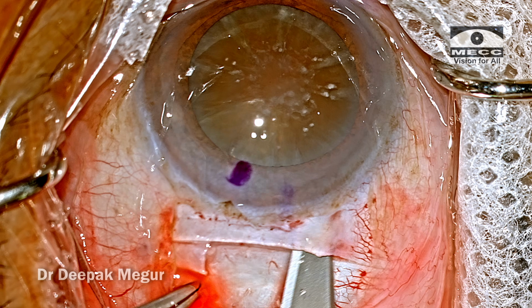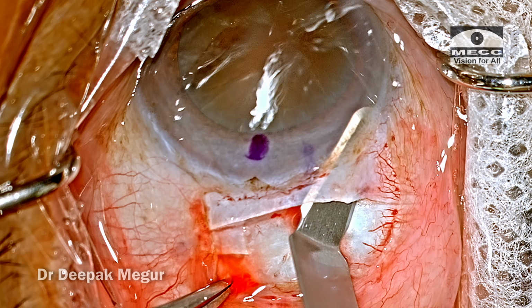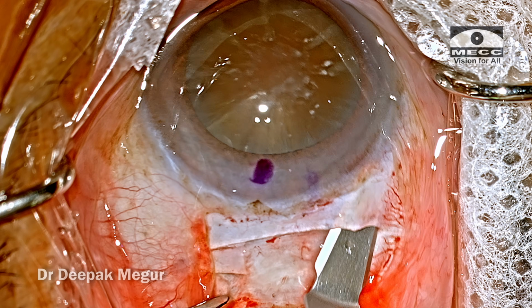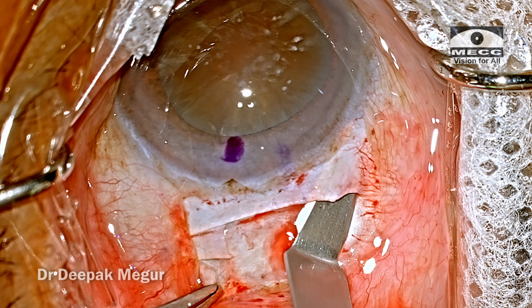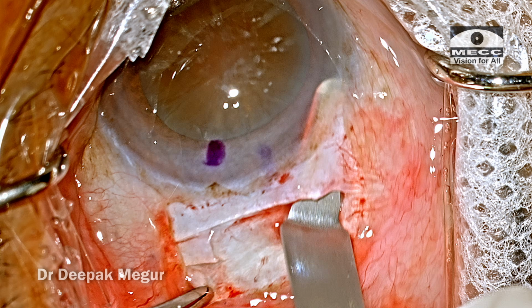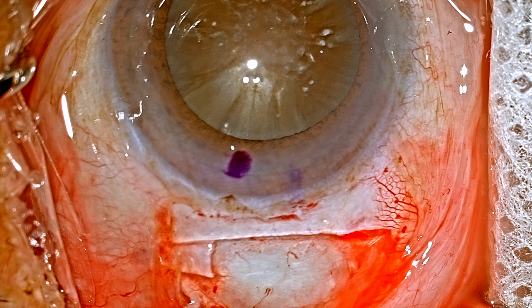This concept has to be clearly understood because the presence of this internal corneal tissue throughout the entire span of the incision is the one which ensures the valvular nature or the self-sealing nature of this corneoscleral tunnel. So avoid making the incision running towards the limbus in the peripheral part. At least some amount of corneal tissue has to be there between the limbus and your internal incision.